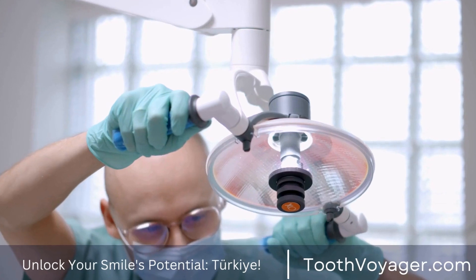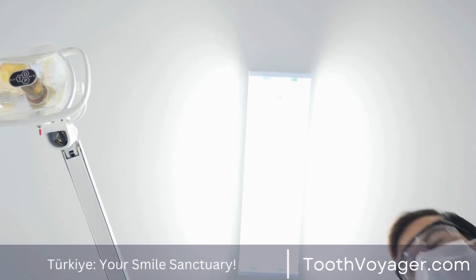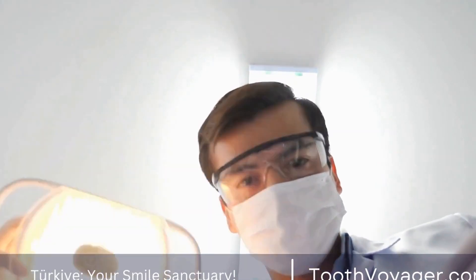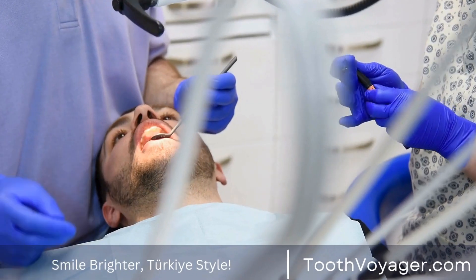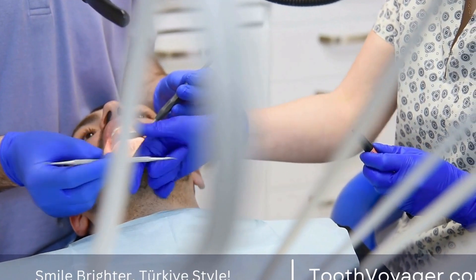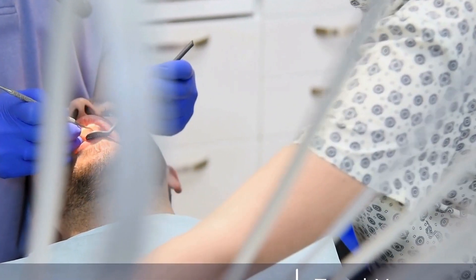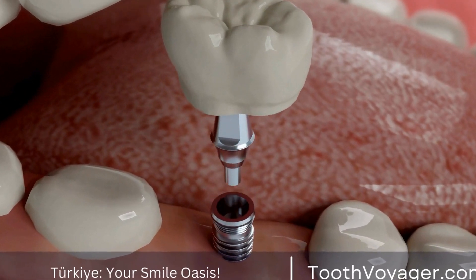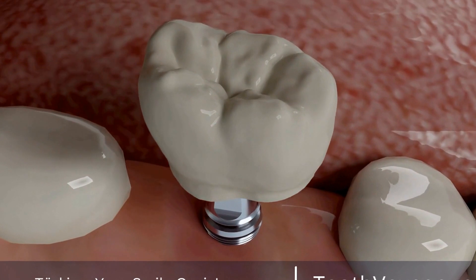Step 1 – Initial Consultation. The first step in the implant dentistry process is the initial consultation with your dentist. During this appointment, your dentist will evaluate your oral health and determine if you are a good candidate for dental implants. Factors such as bone density, gum health, and overall oral hygiene will be taken into consideration.